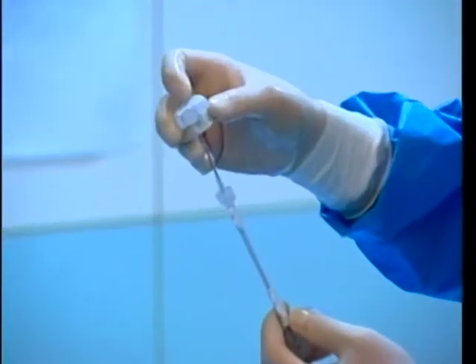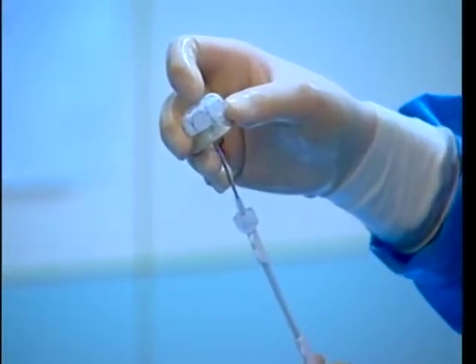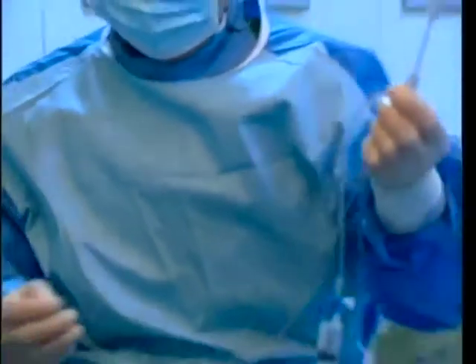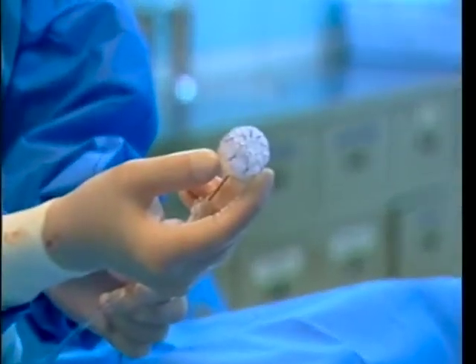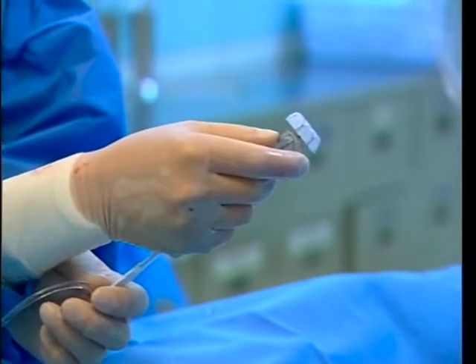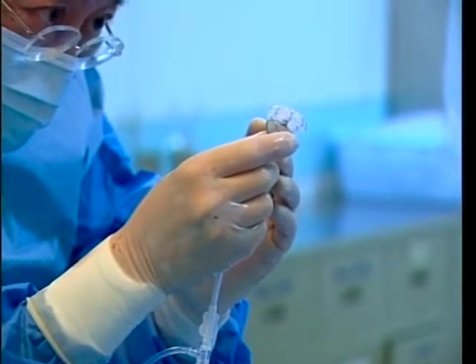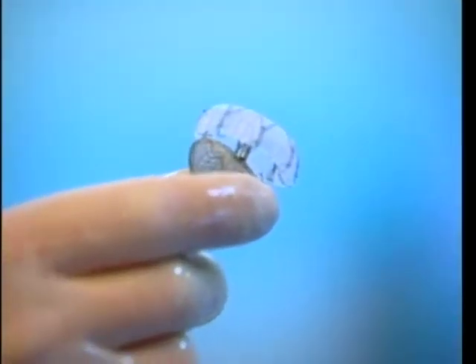Camera closer, please. Zoom closer. Zoom more. You can move it here. Keep it still, don't move around. Closer to the camera. Better? Zoom in and keep it still. Okay, and turn it around so we can see it from the side. Okay, and focus. Can you show us the different types of hooks which are there? But don't move the device, because otherwise the cameraman cannot follow. Getting better.